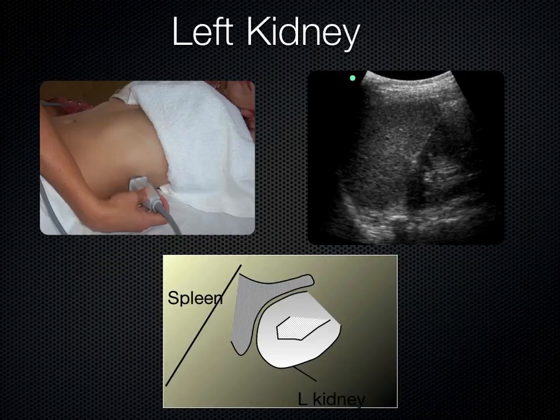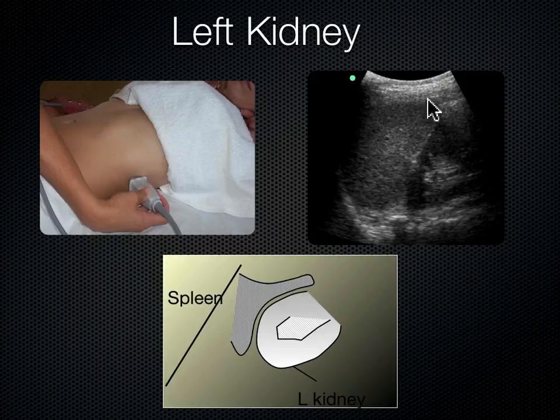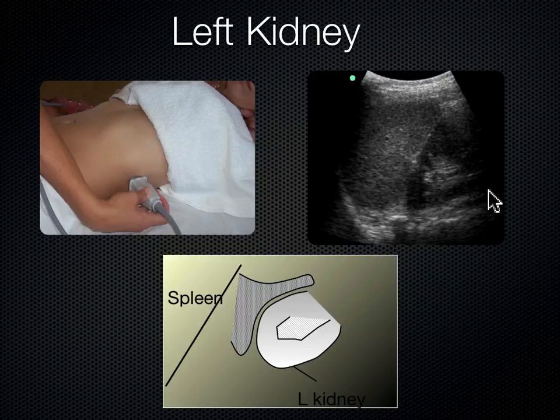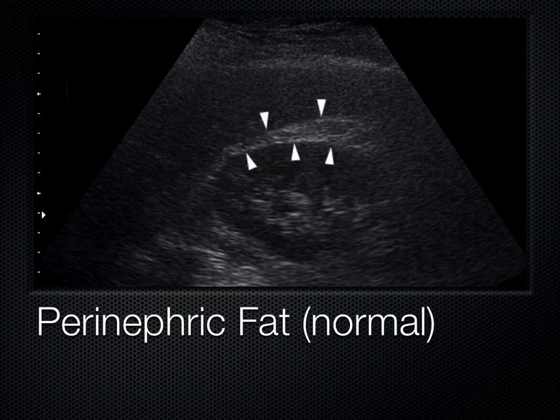The left kidney is more towards the head and more towards the bed — meaning more superior and more posterior. The tip of the spleen is a little smaller than the liver, so we lose part of the left kidney's window when taking that coronal approach. Many times, we need to get more posterior on the left kidney — come around the back a bit more.